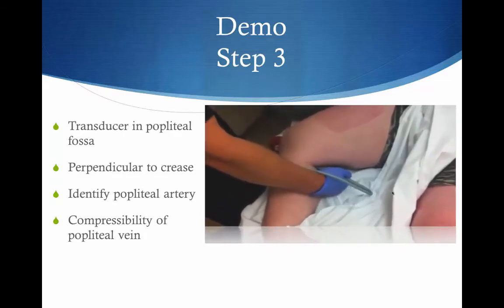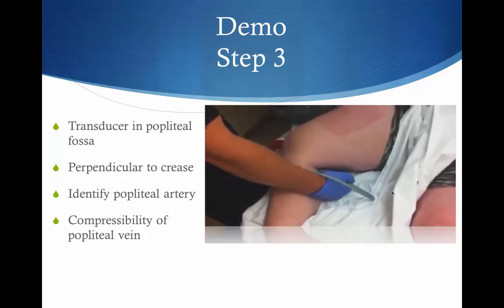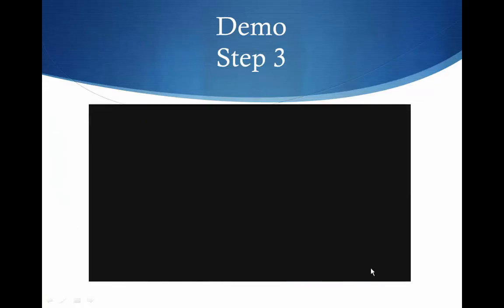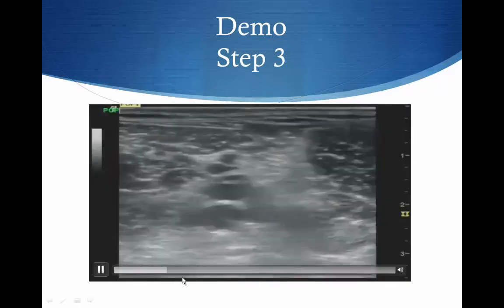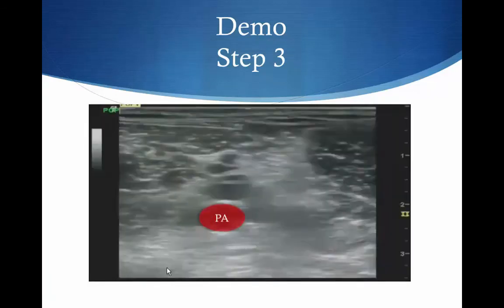And this is great camera work too, I'm just going to point out. Vertically, pressing in on the vein and checking for compressibility. Now we'll look at what the veins might look like on the screen. Here's a rapidly flashing screen, but I wanted to point out to you here, the popliteal artery is deep, so that's an important piece here. Then the vein sits on top of the artery on the screen generally.